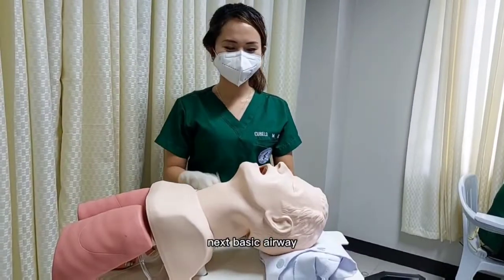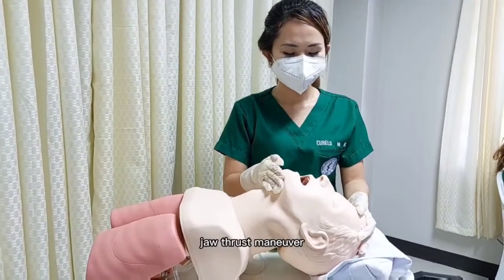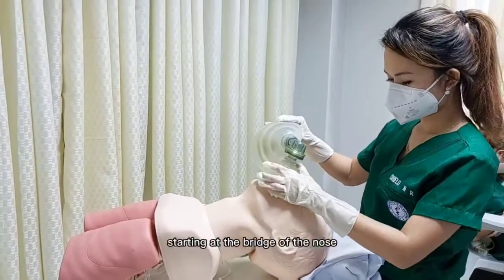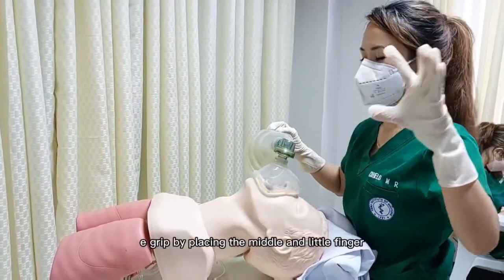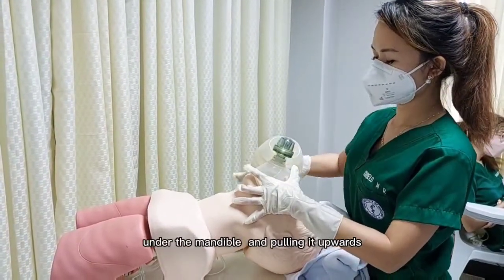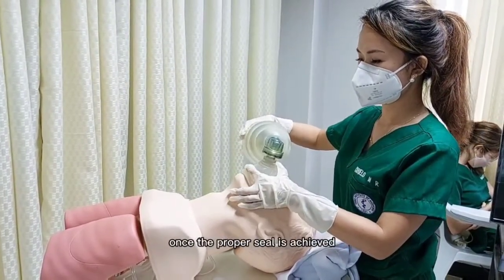Next, basic airway. First is to suction the secretions to prevent obstruction of the airway. Perform a head tilt jaw thrust maneuver in order to displace the tongue anteriorly and place the bag valve mask, starting at the bridge of the nose and lowering the mask over the patient's mouth. Perform the CE grip by placing the middle and little finger under the mandible and pulling it upwards. Index and thumb should create a C, and begin ventilation for a few minutes once the proper seal is achieved.